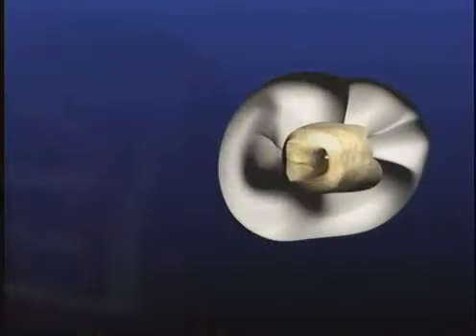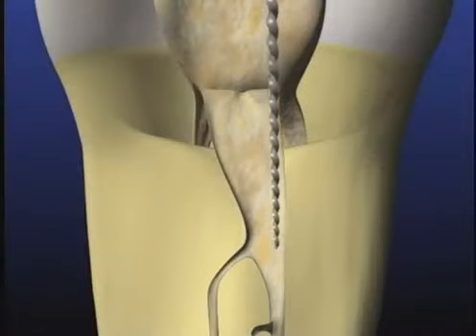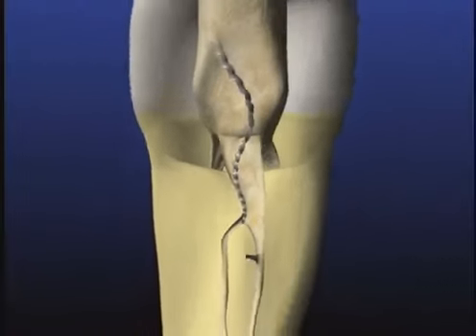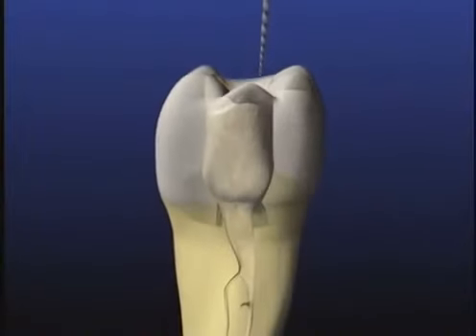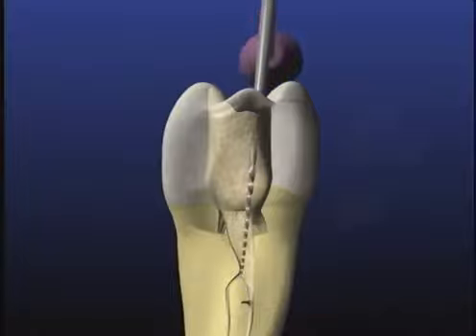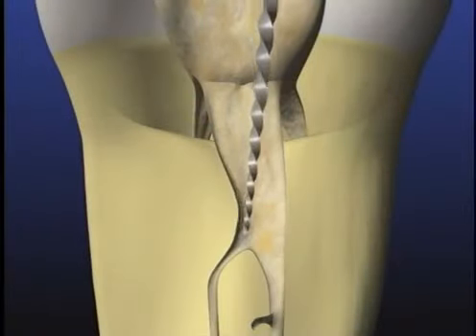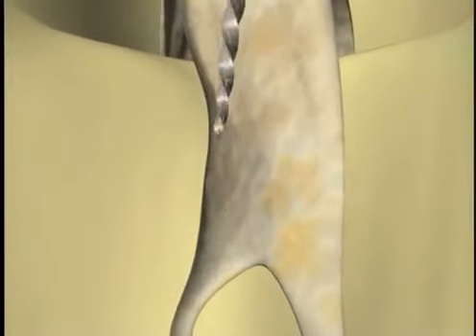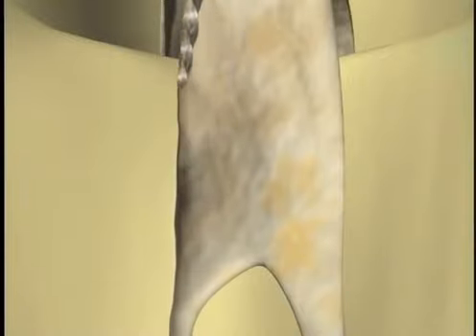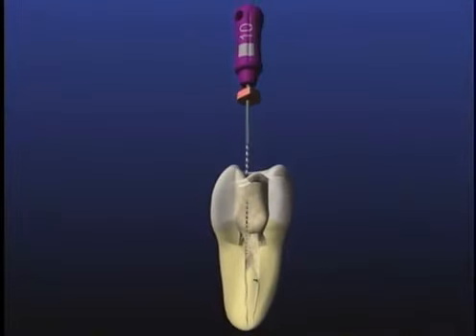Typically, handles and fingers that engage those handles block and limit vision, and even when you can begin to get into the canal, oftentimes the instrument collapses as it is too thin in its taper. A micro opener has an offset handle and can be pre-curved, and because of their double and triple tapers, they afford the rigidity one needs to begin to move into these canals. Properly curved and a few short pull strokes begins to remove restrictive dentin. A few more strokes begins to improve the glide path. Gates Glidden drills can now be used to flare the orifices. This facilitates the subsequent introduction of small hand files.